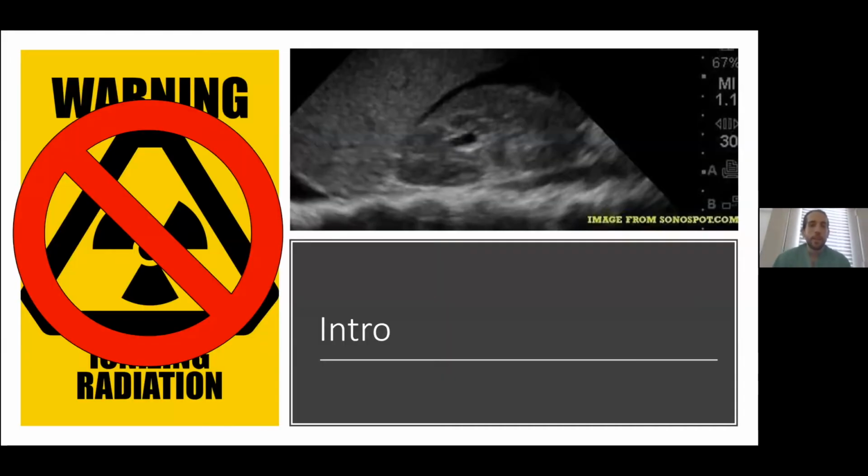So by way of introduction, I think we all know the value of point of care ultrasound in trauma, namely the FAST exam or EFAST exam, to be used for hemodynamically unstable patients, highly sensitive for detection of free fluid, rapid, available at the bedside, expedites the patient to go to the operating room for definitive care without any delays of needing to go to CT.